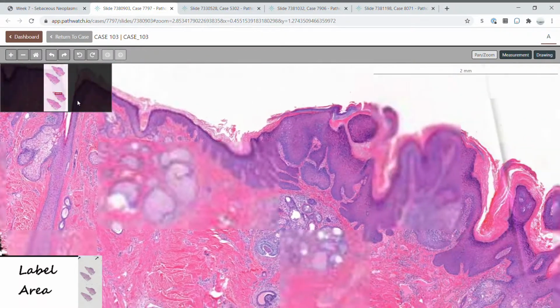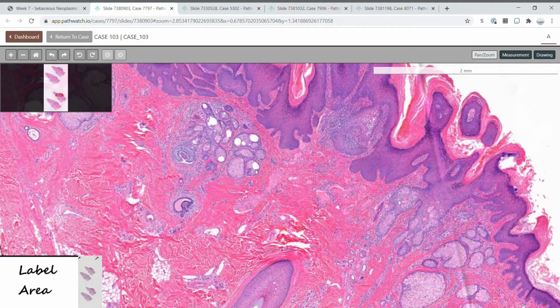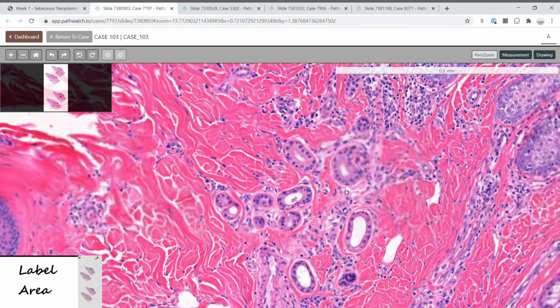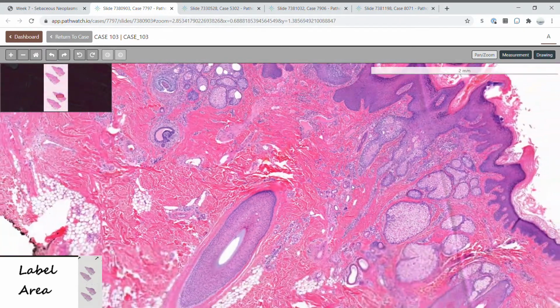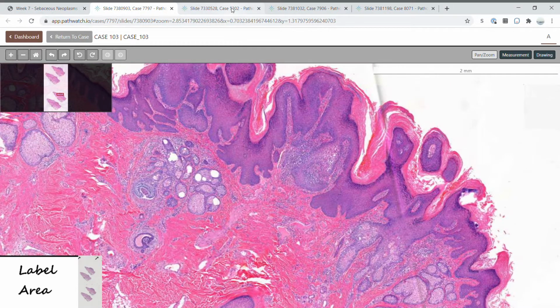Here is a nevus sebaceous. You can see here that there is surface papillomatosis, as well as a proliferation of sebaceous glands and sometimes apocrine glands. Nevus sebaceous has an increased risk of basal cell carcinoma, trichoblastoma, and syringocystadenoma papilliferum.